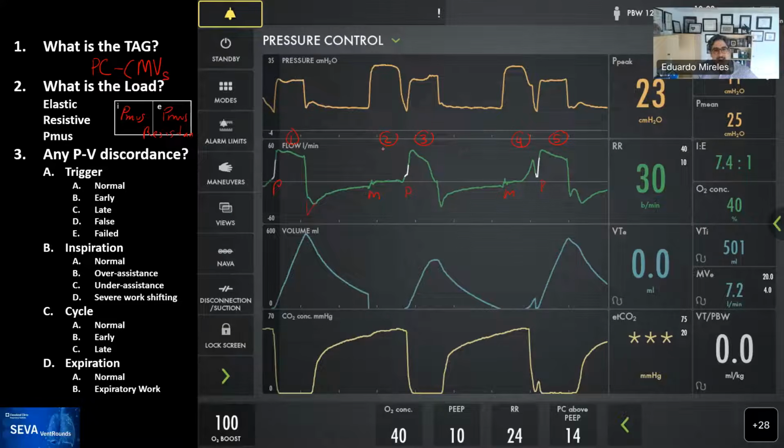That is a pattern that we would call the machine triggered before the patient. Machine before patient tells you that the machine started earlier than the patient. Remember, the patient is the reference. So the machine started earlier in regards to the patient, and so this would be an early trigger, which we also call reverse trigger. Now, sometimes in these machines, when there's very high resistance, you can have a false trigger, but there's many features, as Rob highlighted, that make us think that is not the case.